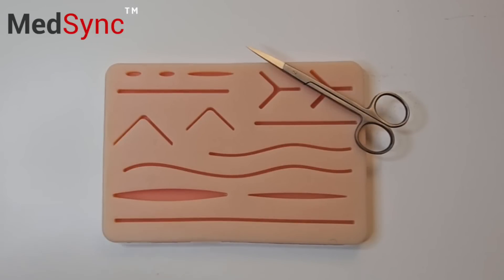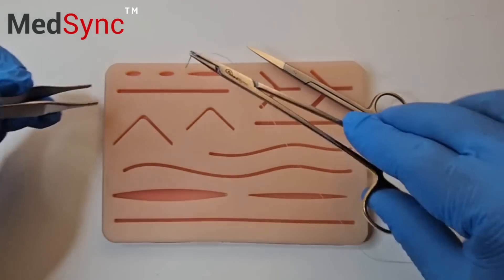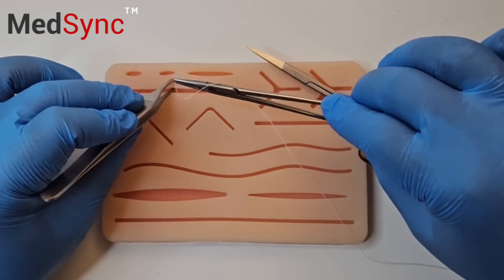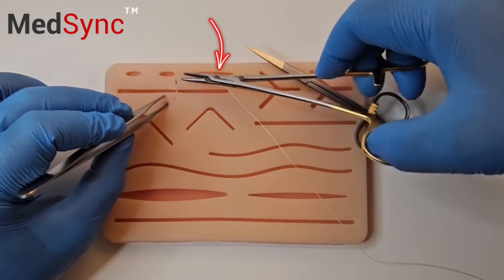You have to perfect the suture technique before you can continue. The interrupted stitch: you enter at 90 degrees and rotate your wrist. Push the suture through.